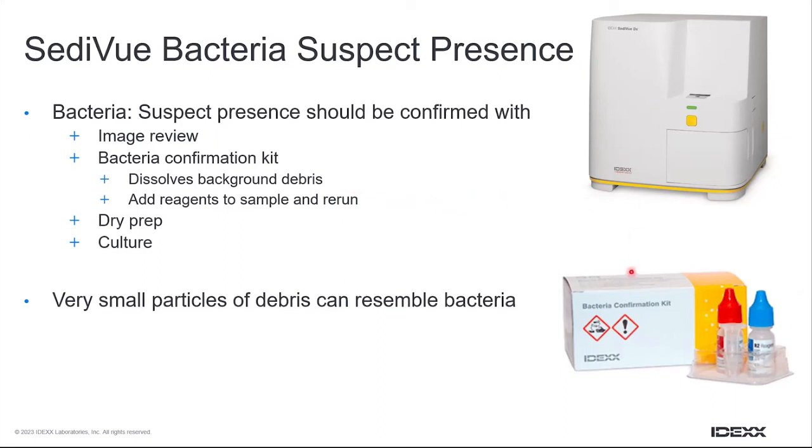So if you do have a SediVue and it comes up suspect presence, I strongly advise you to then use the bacterial confirmation kit to be more comfortable with whether it is a real finding or not. But of course, the other option is an image review.